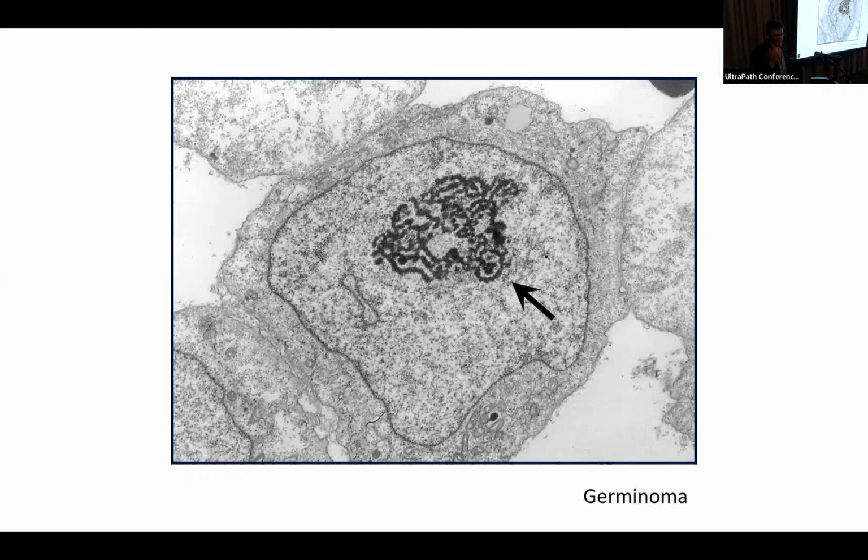And I will mention that in this intro part, we're going to be looking at many tumor examples. Electron microscopy isn't used as often for tumor diagnostics, but it still has its applications, and so a lot of these images will be from our tumor collection, explaining some of these organelles. Like in this case here, in some instances the appearance of the nucleolus can provide some diagnostic information. In this example, this kind of sprawling, ropey nucleolus suggests that this tumor would be of germ cell origin.